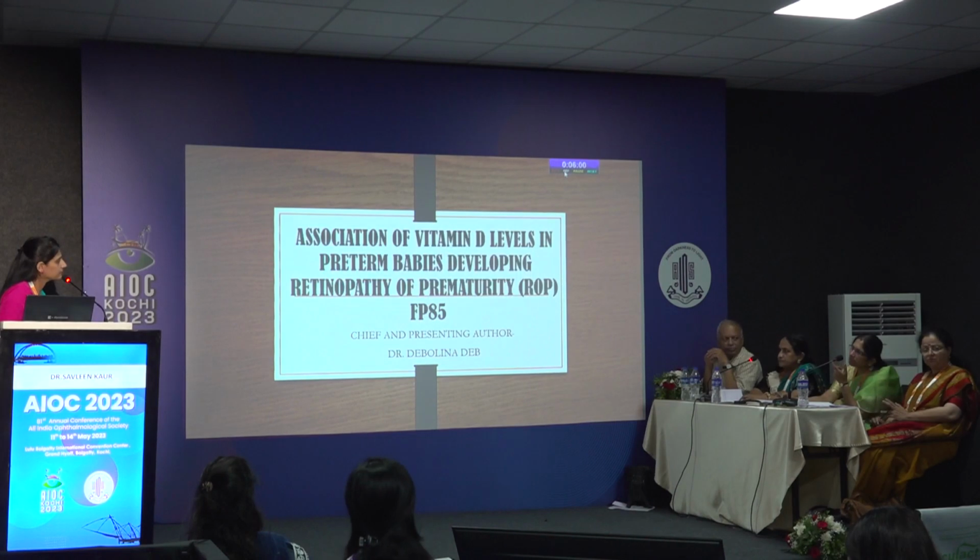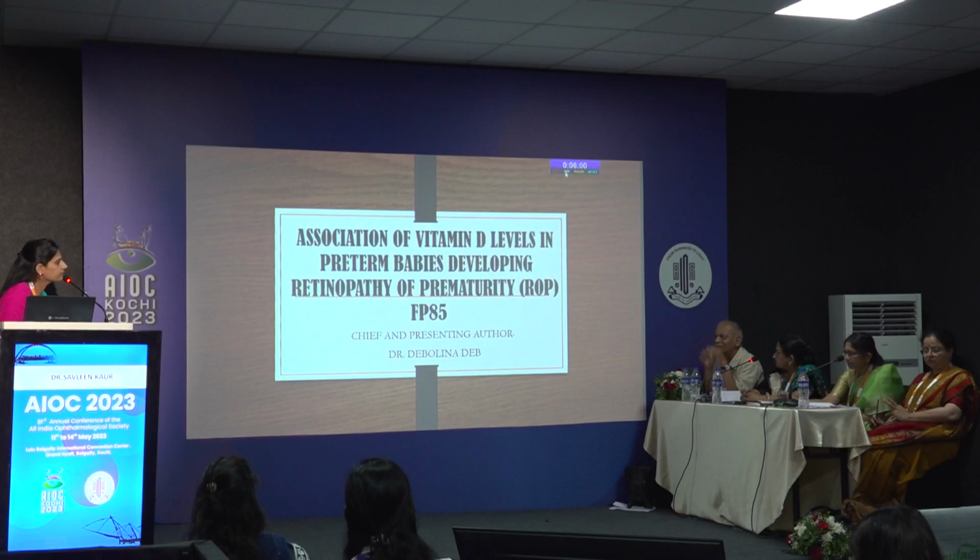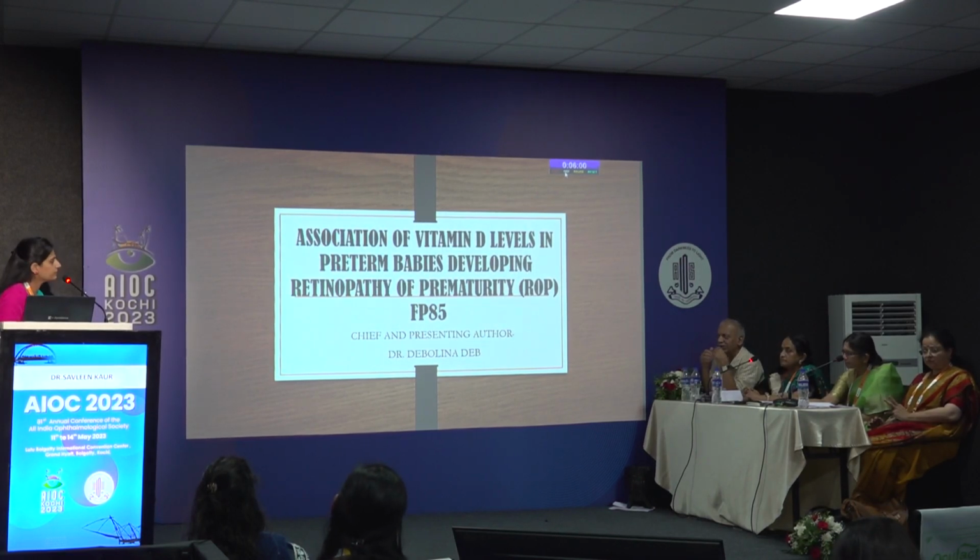Do you use a speculum? Ma'am, I have not actually, because that makes it into a contact method, so then the whole point is lost. So I have not used the speculum, but you can. We were doing a study on ROP babies where we did use the speculum to get better scans. So only if we suspect capsular pathology, or if it is quite opaque, maybe in those cases it might add additional information. Yes, wherever we suspect a capsular pathology, it will be of immense use.